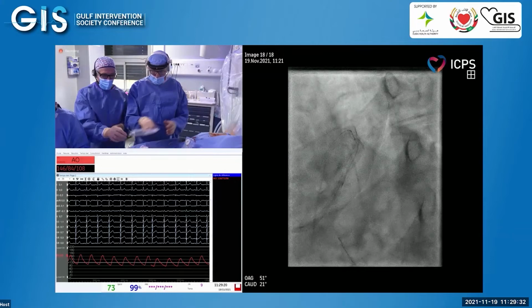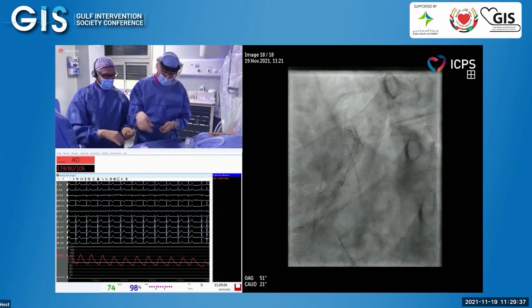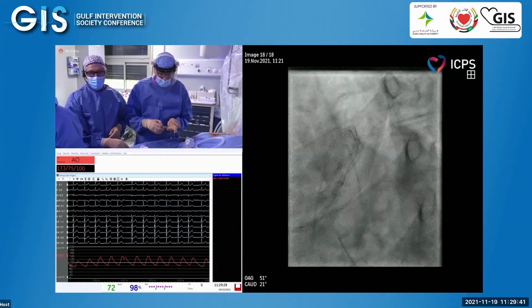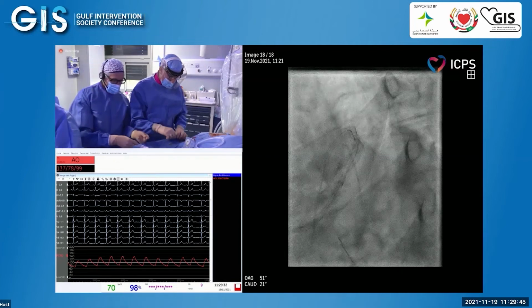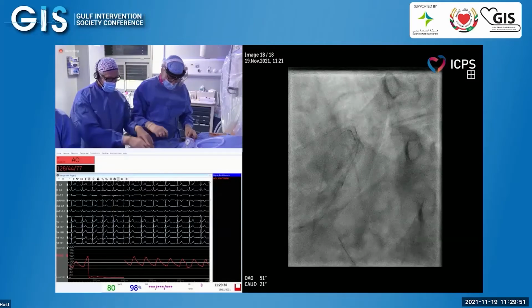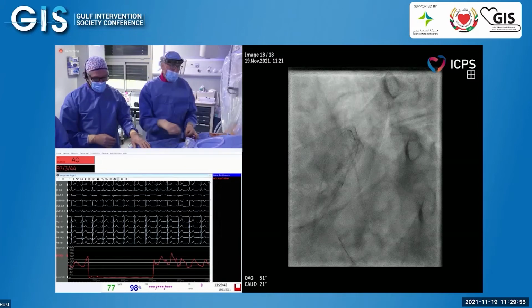This is Dr. Hadi Abuhantaj from Jordan. I commend you on this wonderful case, Dr. Terry. While you are exchanging the balloon, there was an elegant study coming from China, presented in the TCT 2020 about IVUS predictors looking at the ostium of the circ when you're doing distal left main bifurcating lesion.